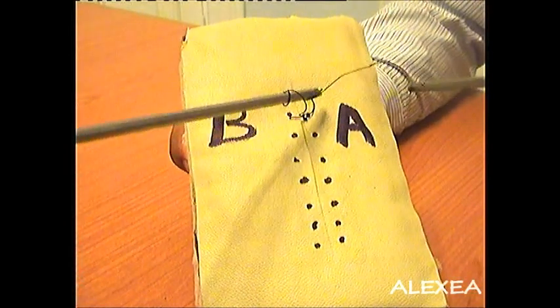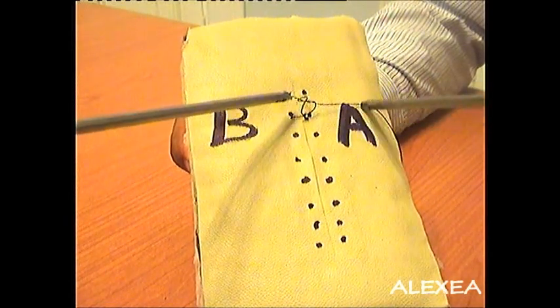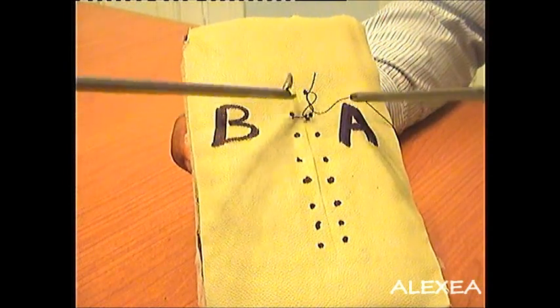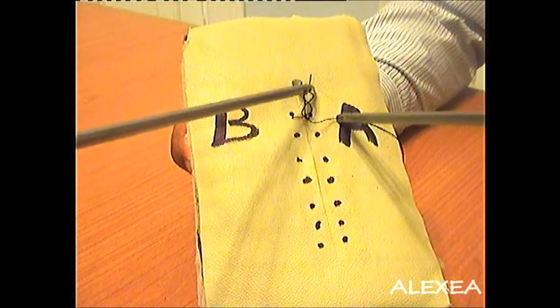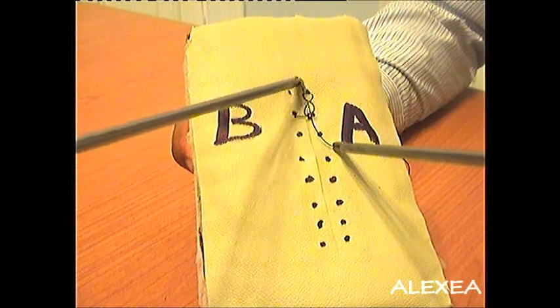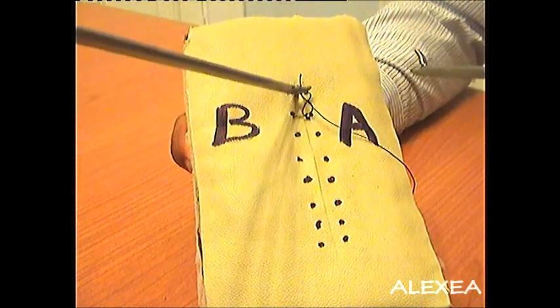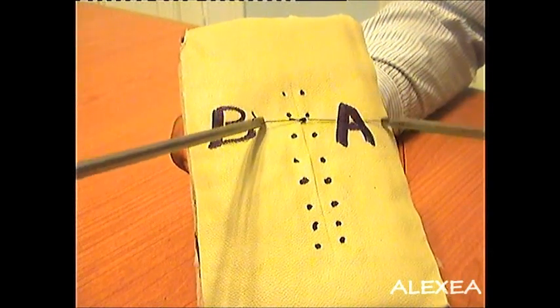And gently release the knot on the longer side, pulling the short side. And complete the knot.